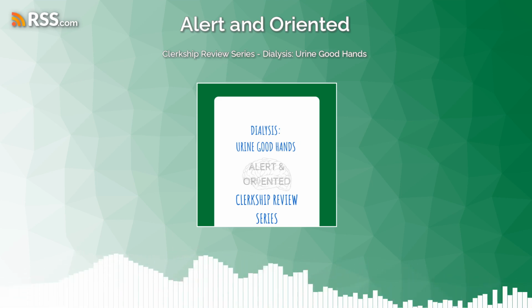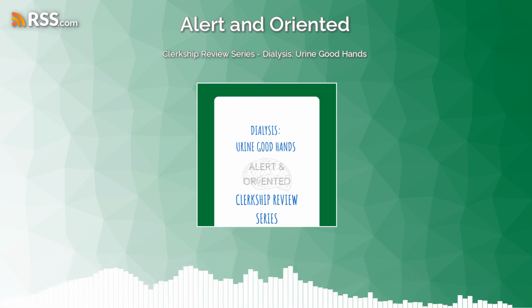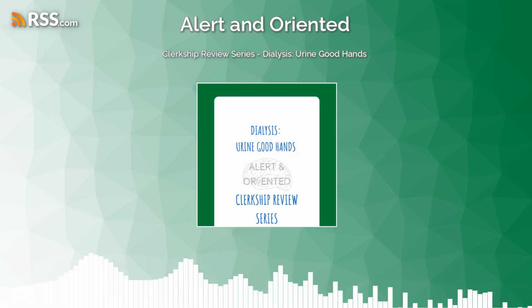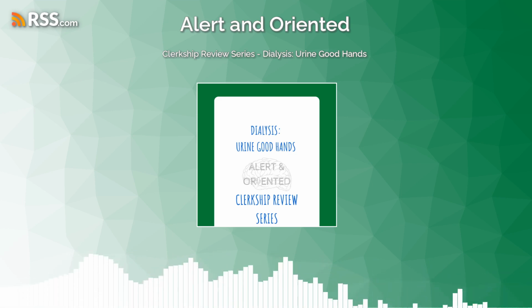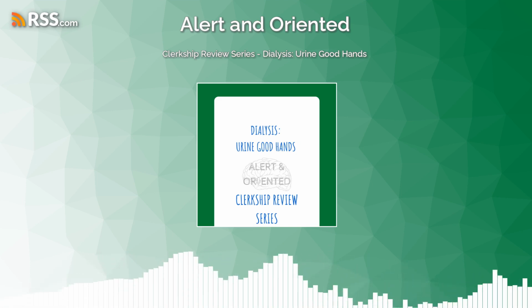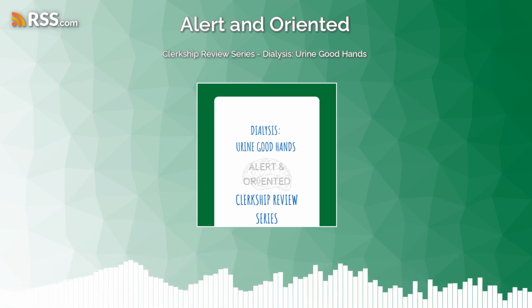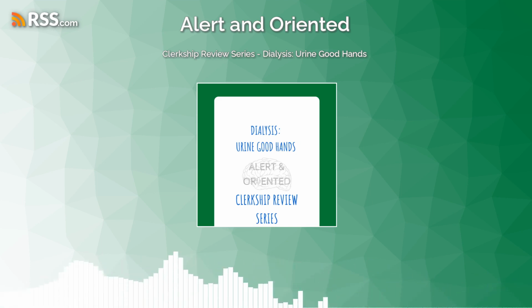If somebody's potassium is low, let's say the potassium is 3.2, we don't want to remove too much potassium. In fact, we don't want to remove any potassium. So we would dialyze that patient against a potassium concentration of 3 so that there's not much of a gradient, so that you're not removing or lowering the potassium too much. So one of the things that a nephrologist would do is adjust the concentration of various electrolytes in a dialysate solution based on what the patient's needs are.